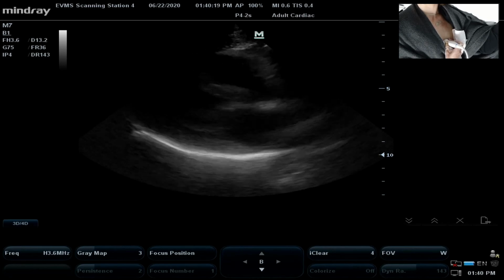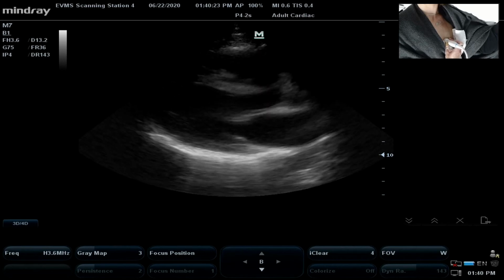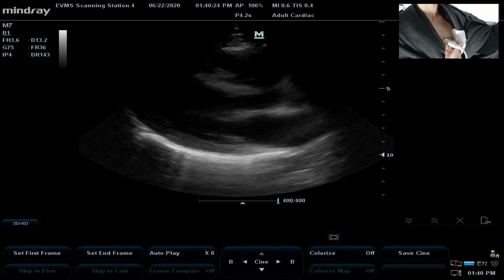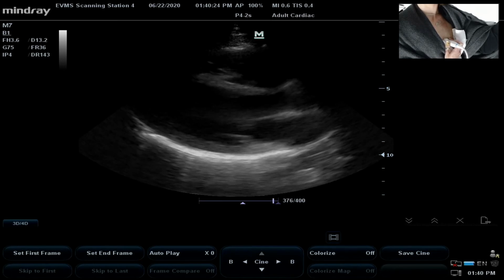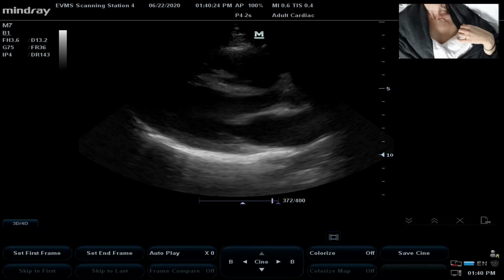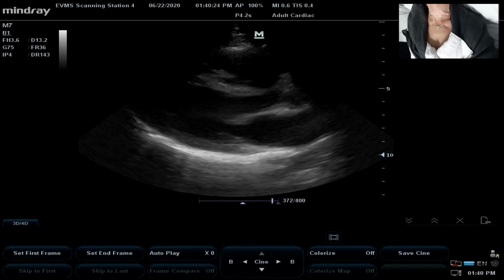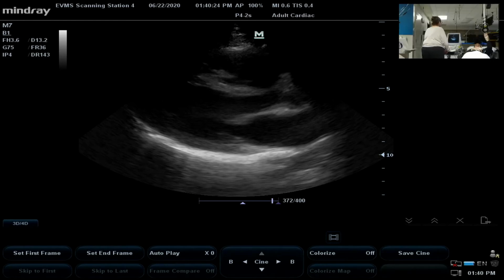You just hold your breath for a minute. Stop breathing just for a moment. And I'm going to freeze what will be the representative image for this lab. Thank you.